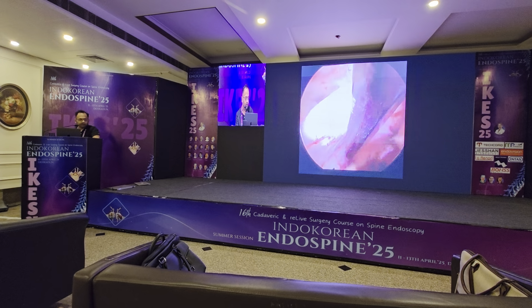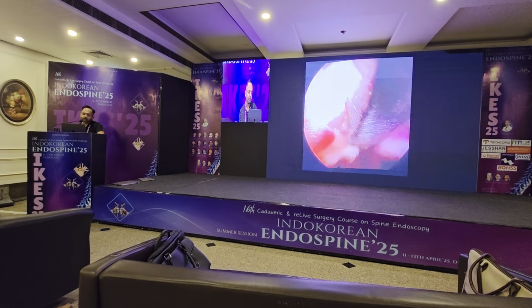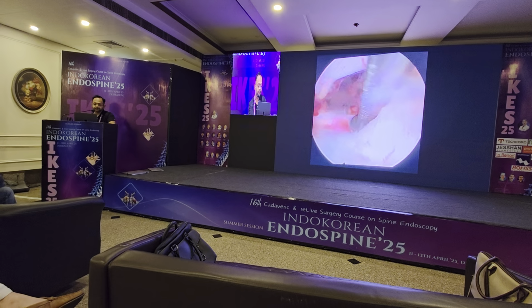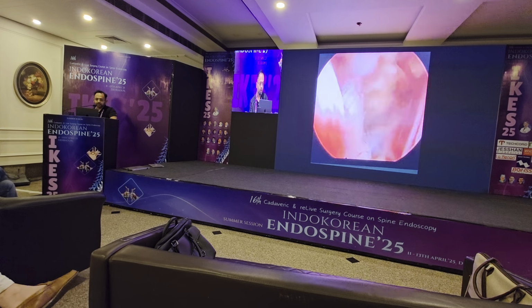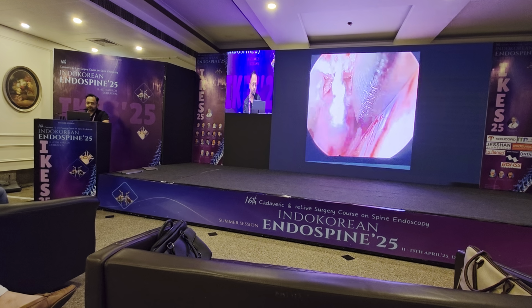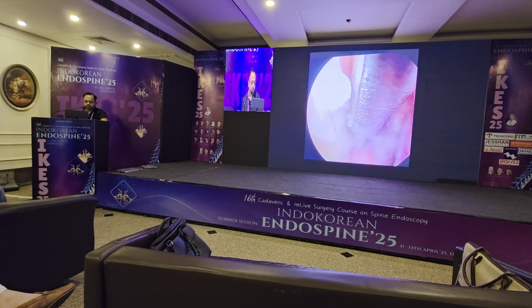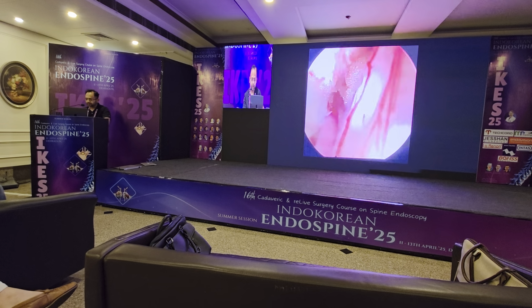You can go to the shoulder, you can go to the axilla, you can go to the other part of the traversing to the opposite side. So you can achieve very good, complete decompression. The traversing, exiting into the foramen.